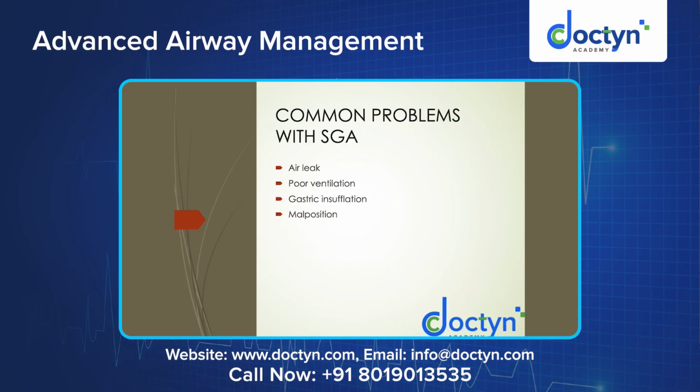What are the common problems? As we have said, there could be an air leak, because it all depends on the seal at the perilaryngeal space. Poor ventilation or gastric insufflation, because just 0.5 centimeters or less behind the larynx is the esophagus, right? If some air leaks into the esophagus, this leads to gastric insufflation and risk of aspiration. And malposition: anytime when you put in the LMA and you move the neck or head, or mobilize the patient from one place to another, there is increased risk of malposition, which will again lead to weak or inadequate ventilation, which would lead to desaturation of the patient.